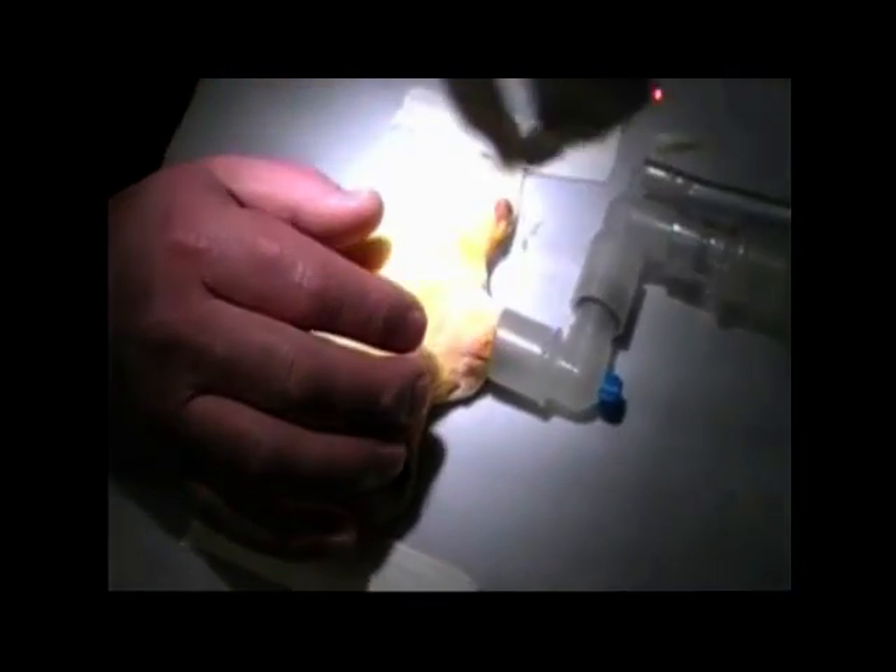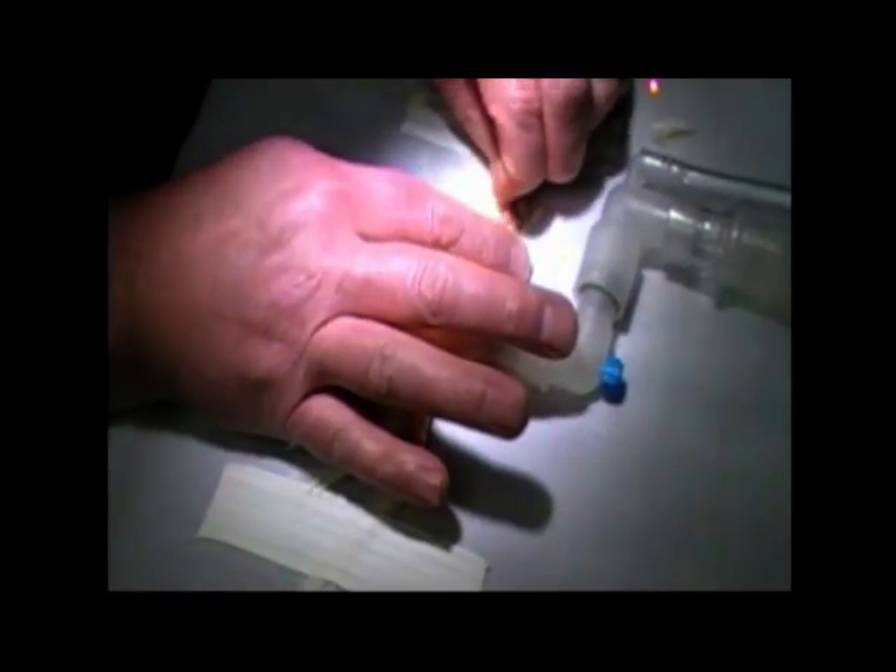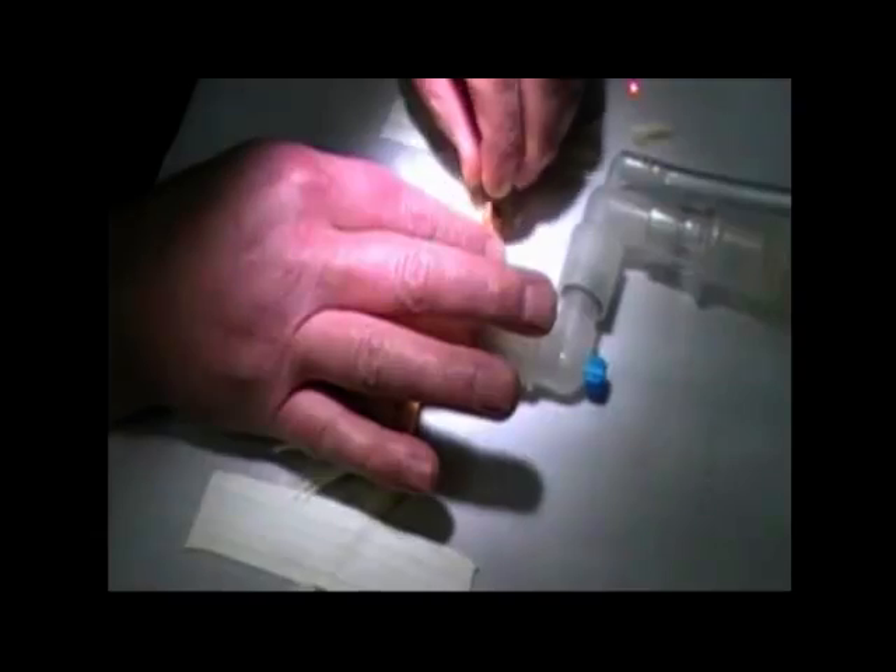I will have my technician turn off the oxygen flow for just a minute while I'm actually doing the laser, because I don't want to have a flare.